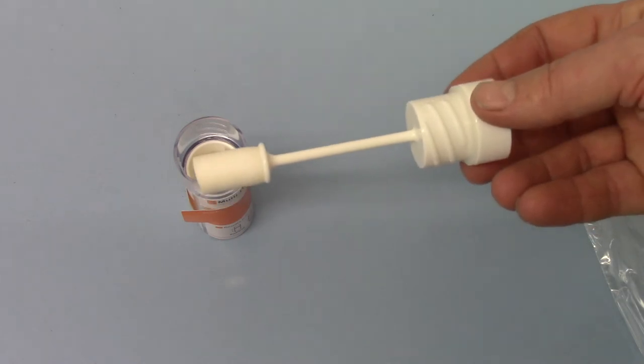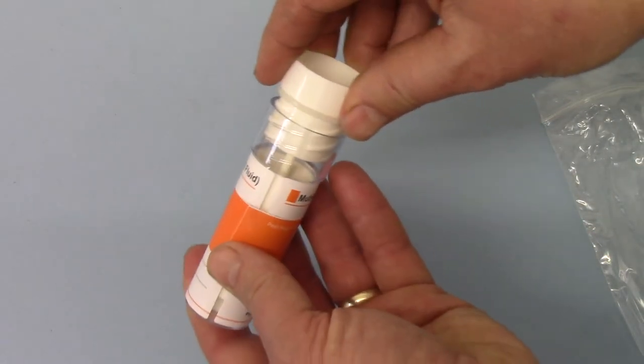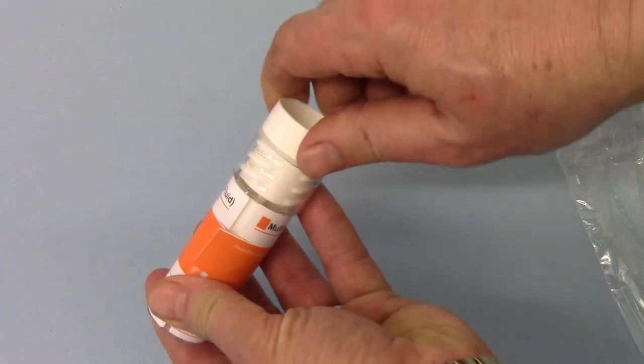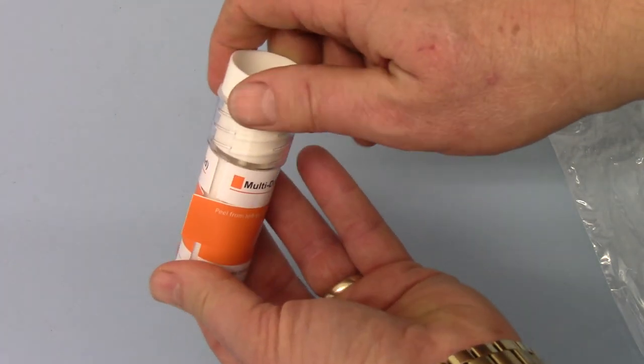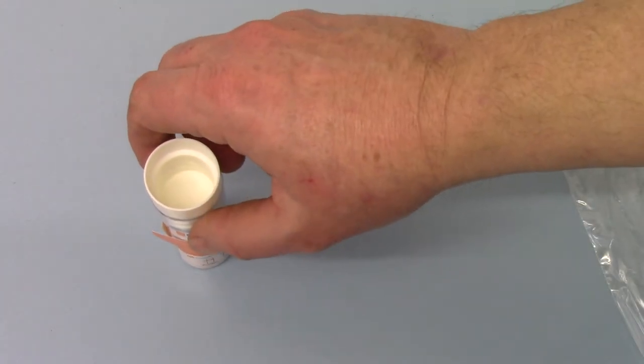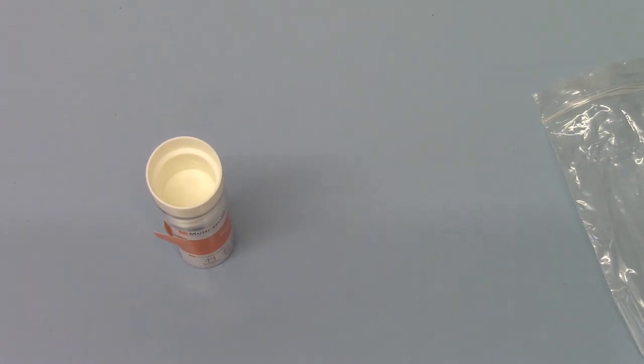And then to run the test, you simply put the swab into the barrel and lock down. Put it upright, and you now read that test at between 5 and 10 minutes.